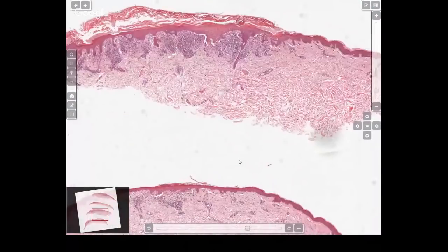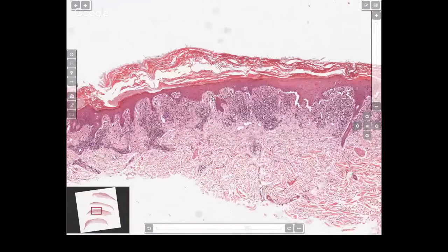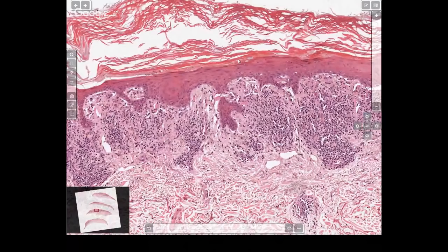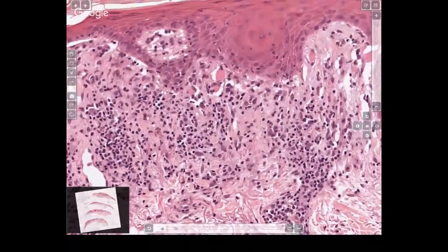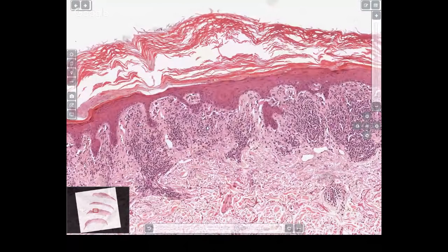Again, it looks very similar, but these tend to have some sort of parakeratosis on the top. Although this slide doesn't show you very good parakeratosis, most cases of lichen planus like keratosis are going to show you parakeratosis on the top, and then the same features: the hypergranulosis, the lichenoid infiltrate at the dermal epidermal junction, and presence of colloid bodies. You can see the presence of these colloid bodies here, and the pigment incontinence in the dermis. So if it is a single lesion, it is lichen planus like keratosis. If it is a rash, then it is lichen planus.